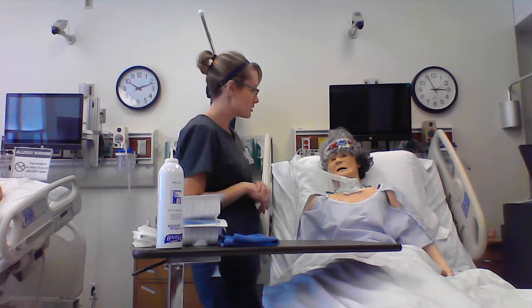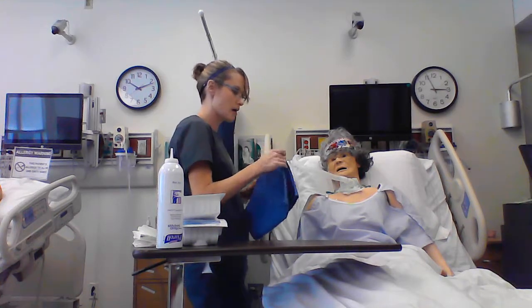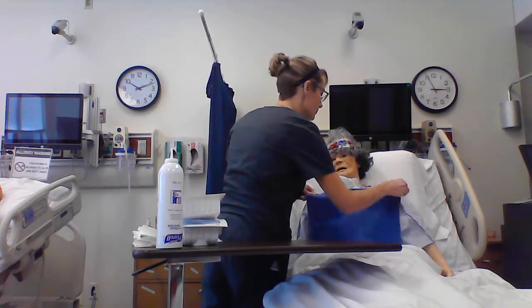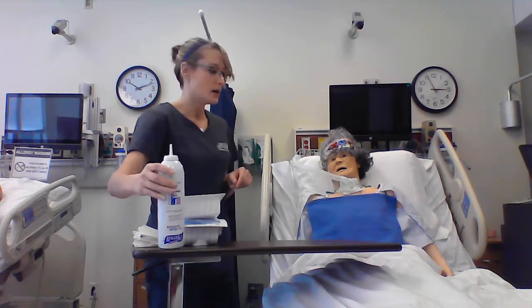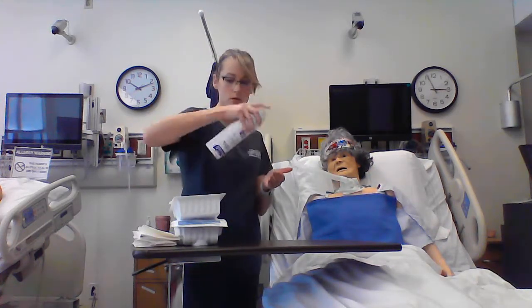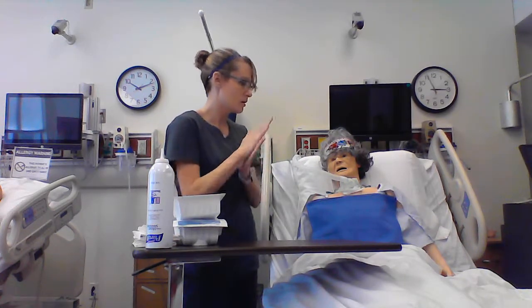So once we're ready to begin, I'm going to go ahead and drape Miss Opal with a towel to keep her as clean as possible during this procedure. Perform your hand hygiene. You can go ahead and open your sterile kit.